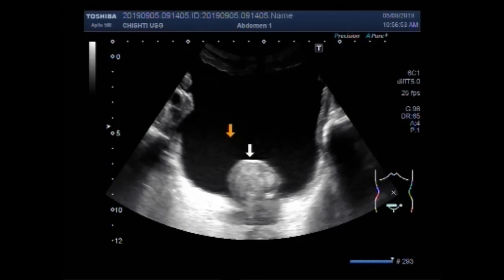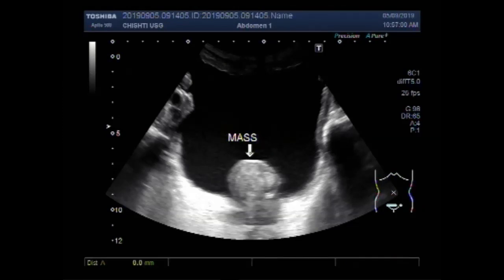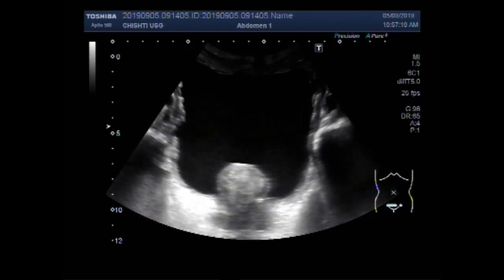The patient is a male patient aged about 63 years. Now you can see the measurement of the mass — the mass measures about 32.1 mm x 34.2 mm.